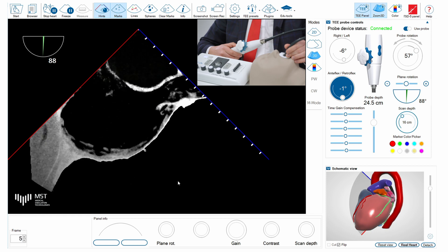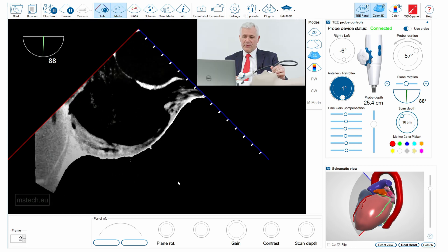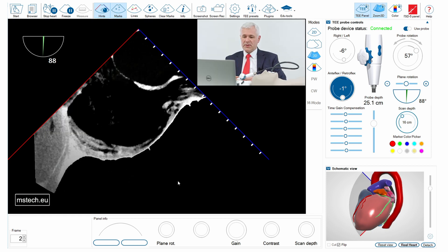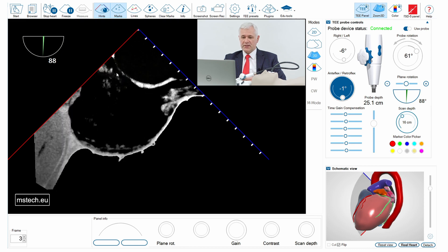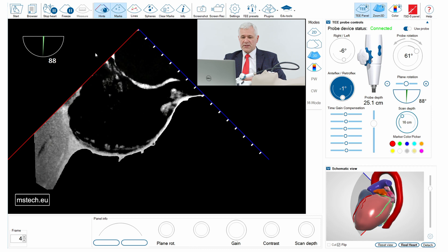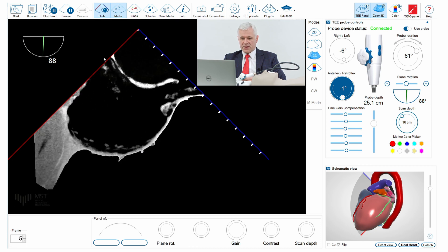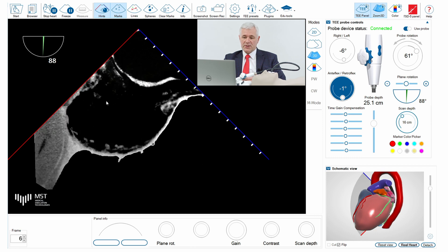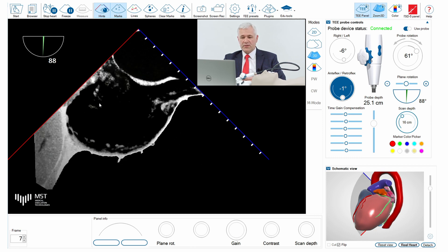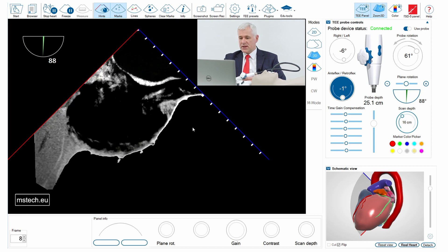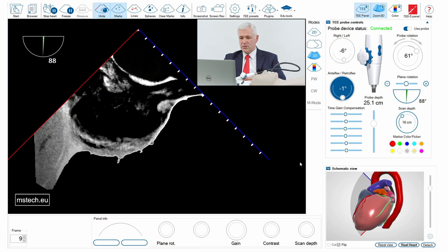Here I have the bicaval view with the superior vena cava on the right-hand side and the inferior vena cava on the left-hand side. We can see some artifacts in the right atrium — this is a CT-derived image, so you can occasionally see some echoes of the non-contrasted blood in the right cardiac chambers, but it does not affect our training.